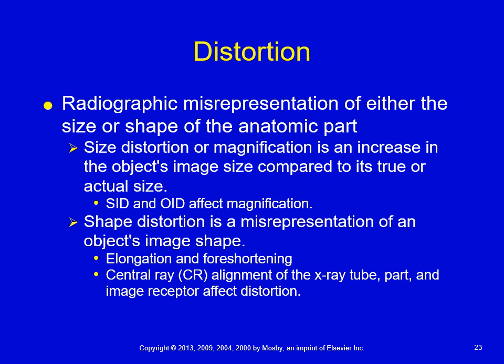Now, when I say magnification, one of the things that we have to pay close attention to in terms of chest imaging is the heart size. So we have a 72 inch SID for the heart. We typically image left lateral, and of course the patient is flush against the board.